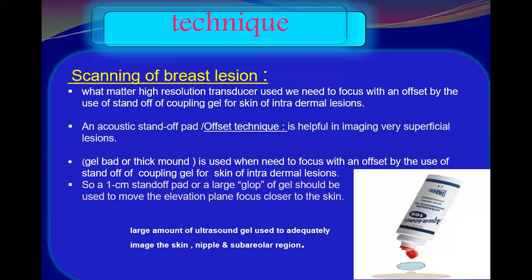Yes, applying a thick gel to see the lesions that are superficial. Why could we not see it well?